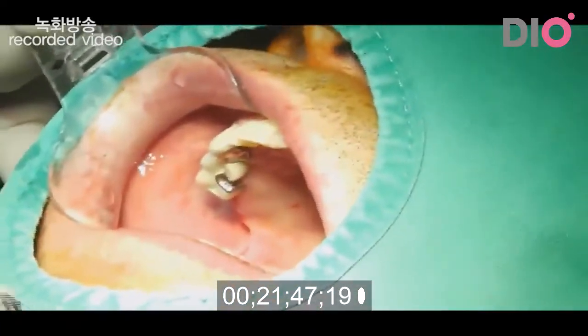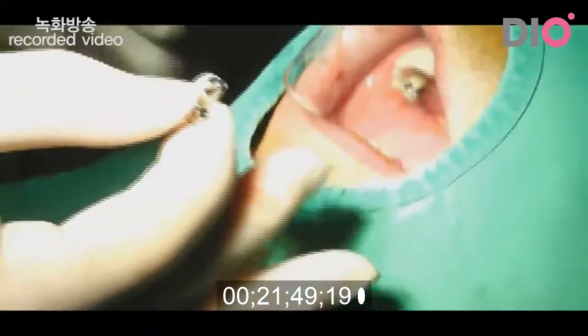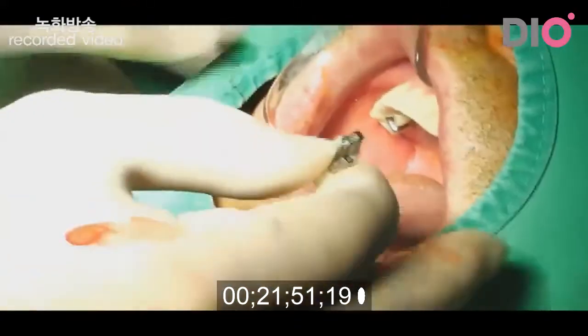Okay, now you can see the bottom of the crown. I place this one. Okay.